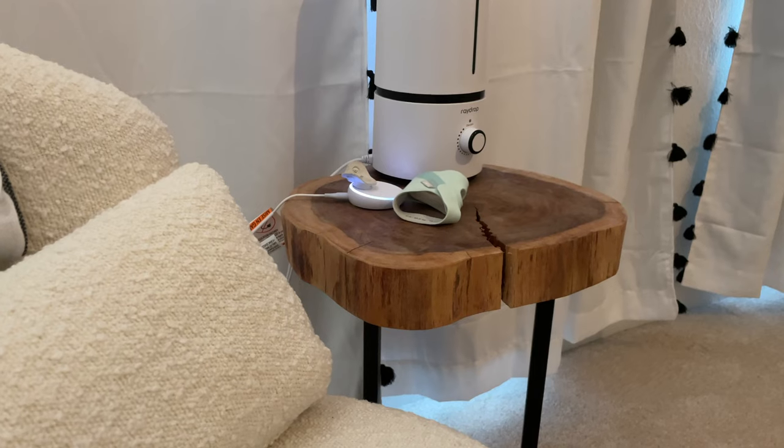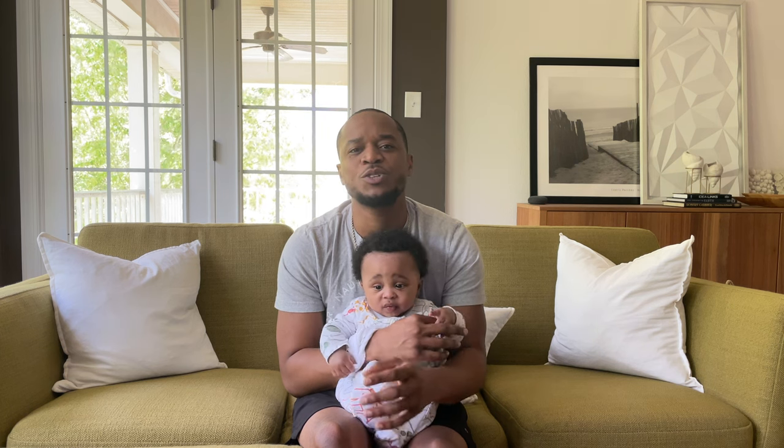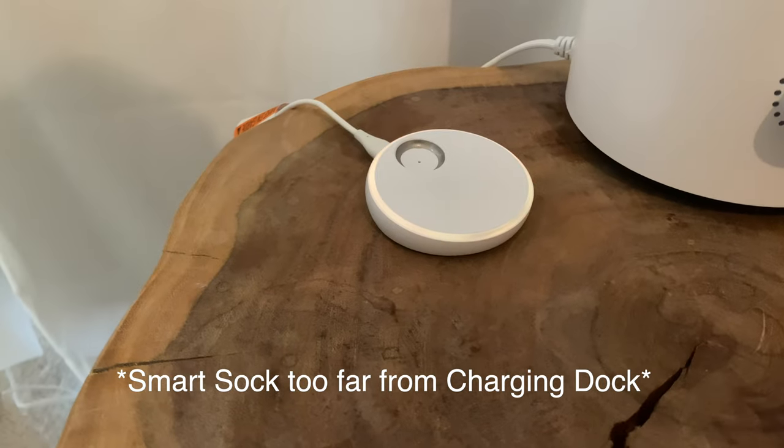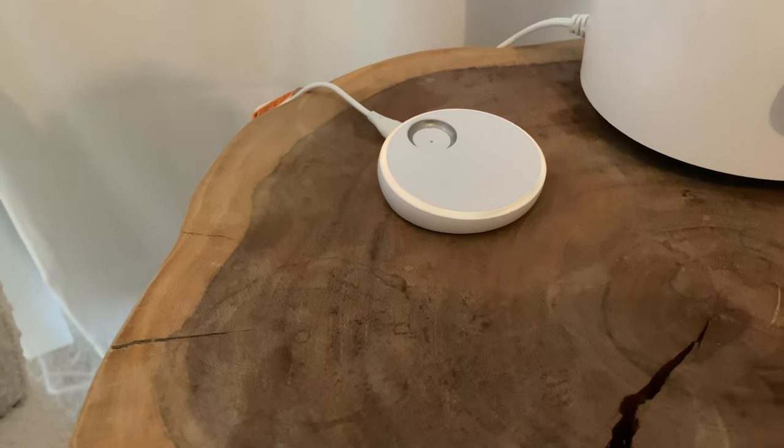We keep the charging dock in the same room as his sock to ensure he's close enough to get good readings, and it's never really had any issues. The only problem we've had is when we've taken him too far away from the charging dock — like downstairs to play or in the kitchen — and it'll chime and tell us you're too far away to pick up the readings. It does that by playing a little lullaby tune on the charging station, as well as through the phone app.